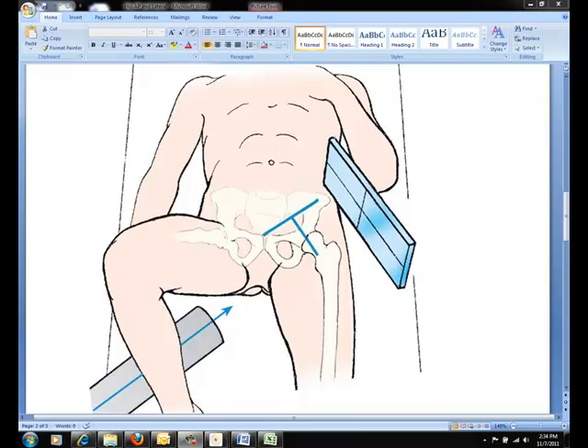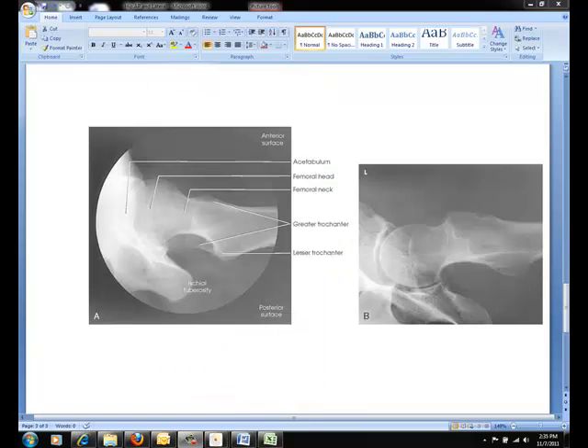Using a 10x12 cassette and a grid will get you the best detail for the acetabulum, or femoral joint space. Additionally, be sure that the unaffected leg is as far out of the way as possible to reduce scatter radiation. If performed properly, when evaluating the image, the femoral neck will be seen without overlap with the greater trochanter, and the soft tissue shadow of the unaffected thigh will not be overlapping the hip joint or proximal femur.